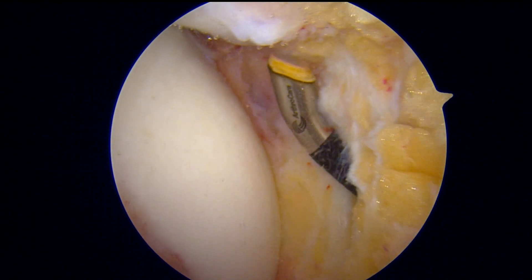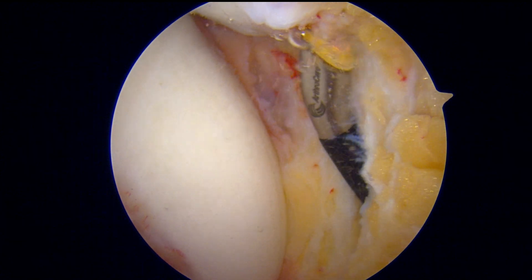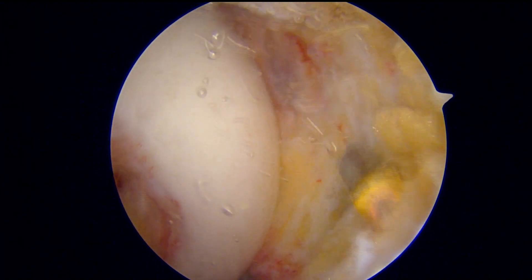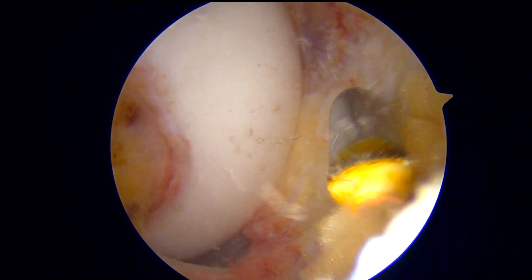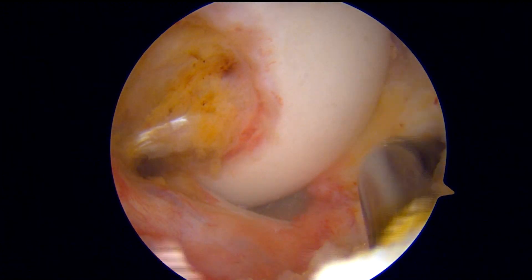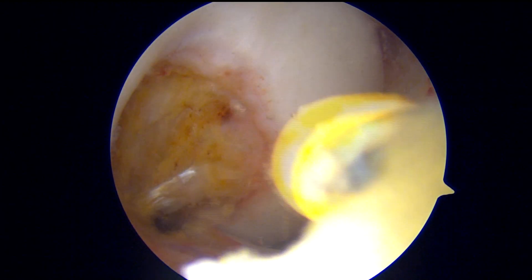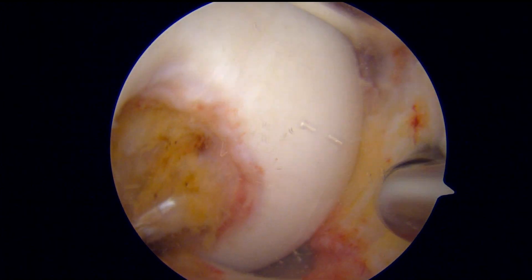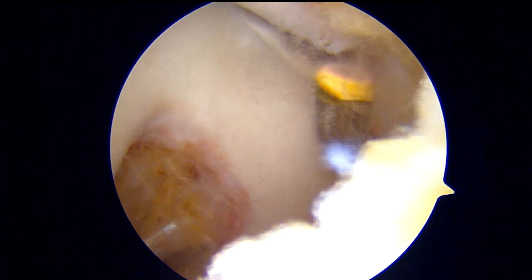We go back to the anterior aspect of the knee behind the patellar tendon in the fat pad, using the ArthroCare wand to not only remove the synovial tissue, but also to coagulate any of the bleeding vessels that may cause a bloody effusion after the surgery.